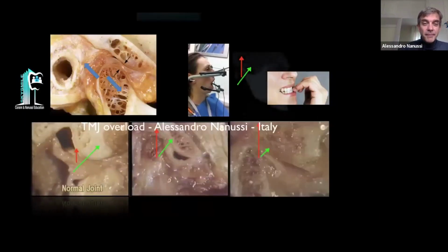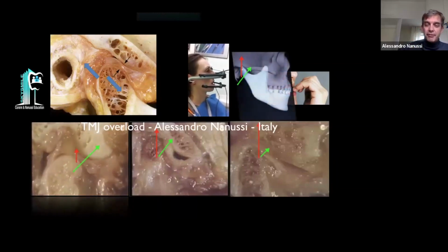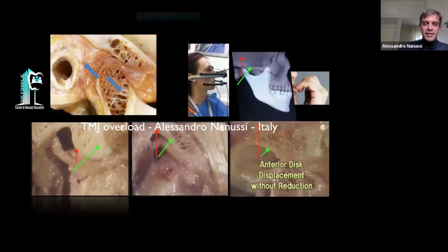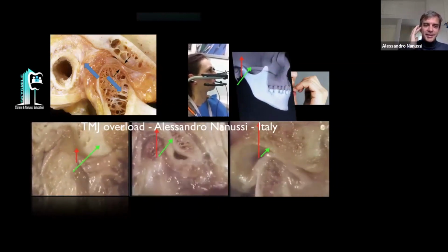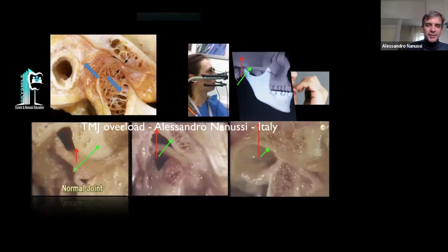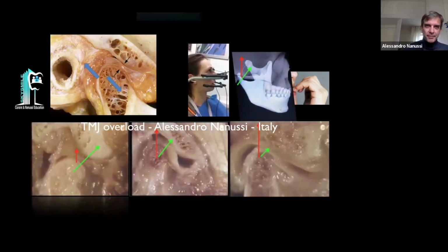And as I told you, when you apply a splint with anterior contact, be careful for the TMJ. Check the position, check the load on the TMJ, and ask the patient frequently if all is going well at the TMJ level, because this position, similar to the night bruxism that someone does, can create an excess of vertical load on the TMJ. So check it.